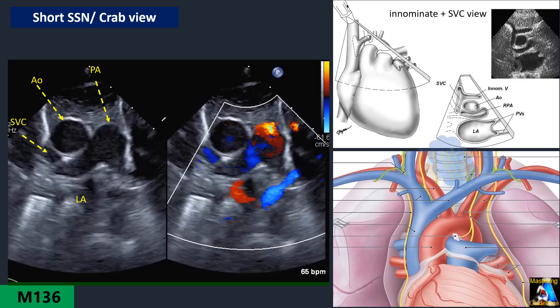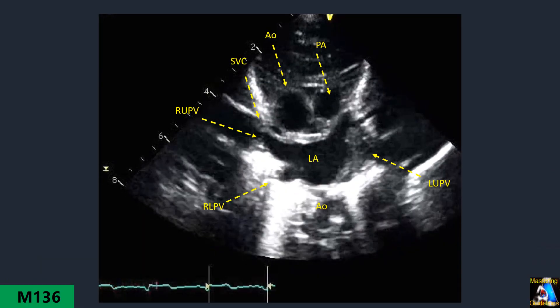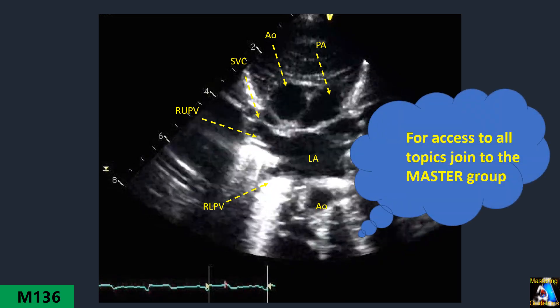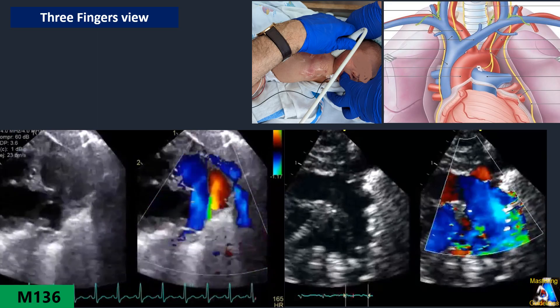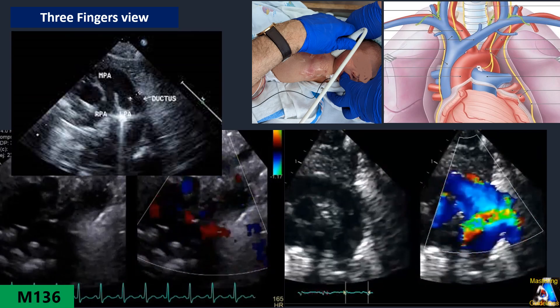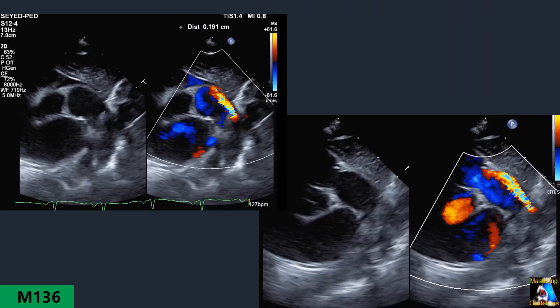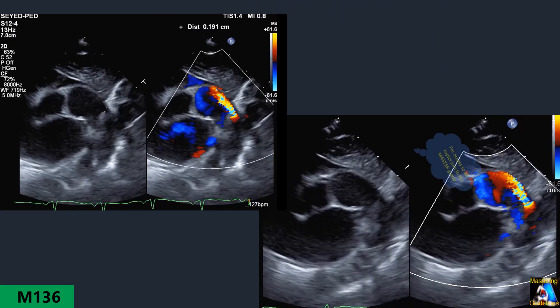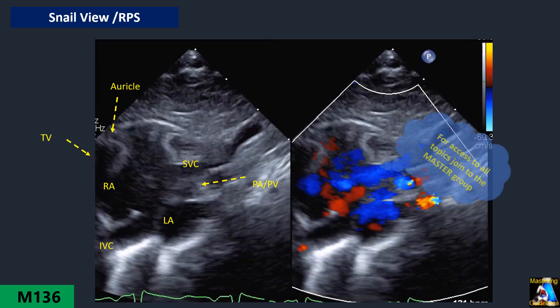We will also cover the crab view, the three-finger view, and the snail parasternal view.